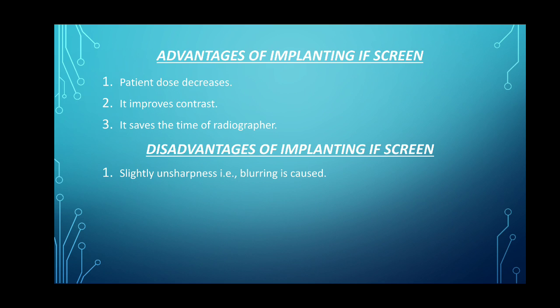Advantages of employing intensifying screens: patient dose decreases, it improves contrast, and it saves the time of the radiographer. Disadvantages of employing intensifying screens: slight unsharpness, that is blurring, is caused.